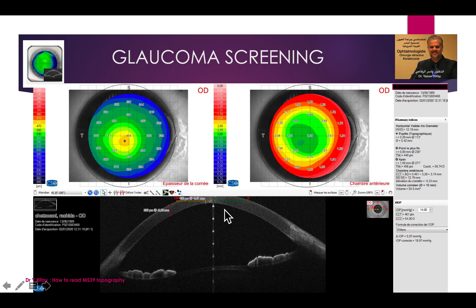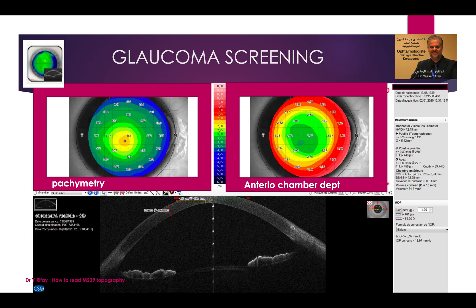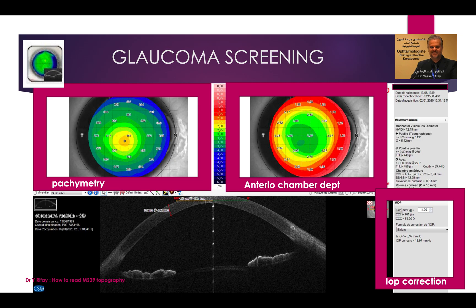You also have glaucoma screening with a pachymetry map that helps you correct the IOP. You have the anterior chamber depth and correction of IOP with different formulas.